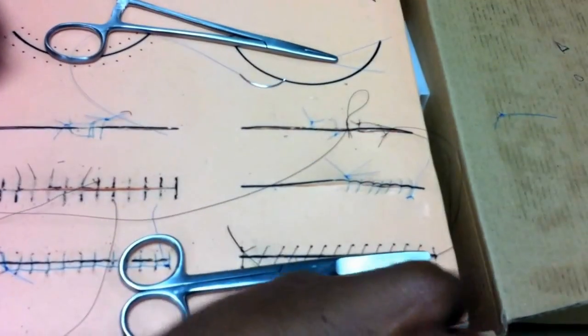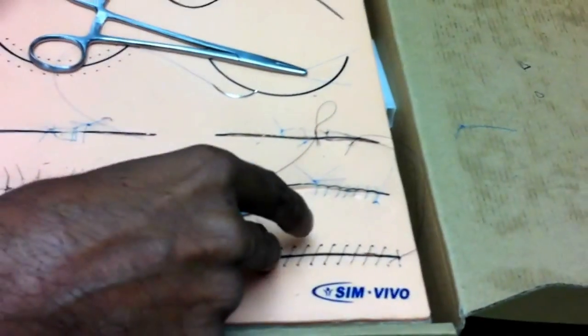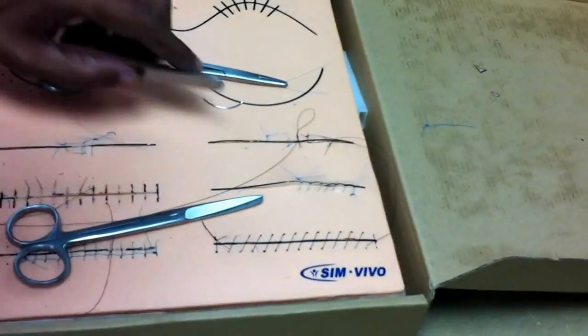So now you can take your respective stations and you can remove the previous sutures and start doing it. You need not make the incision. This incision is already made for you. So this is the technique you do. Just practice with that.